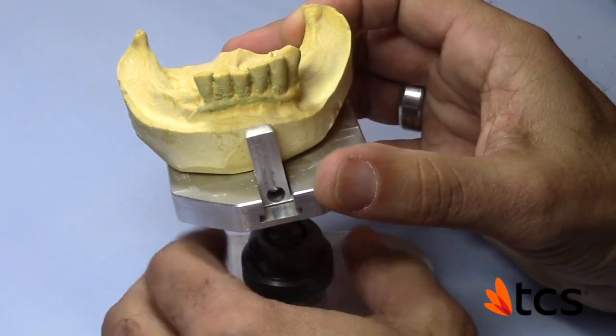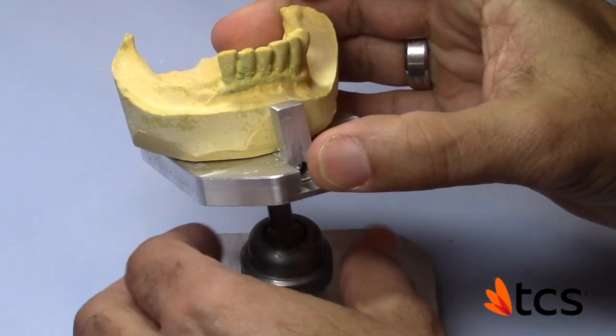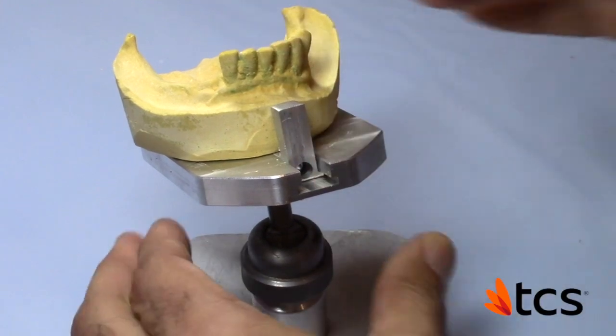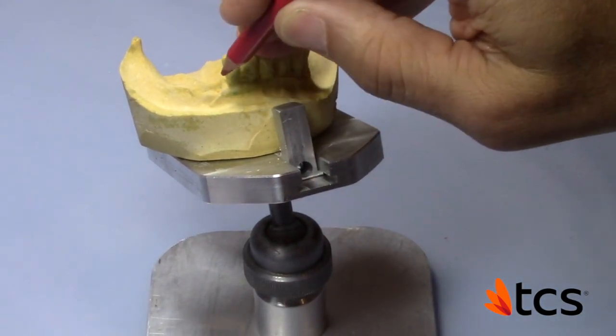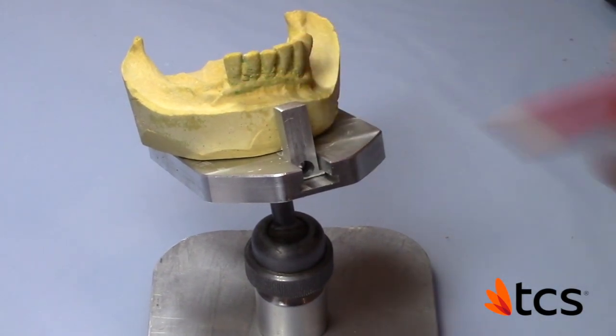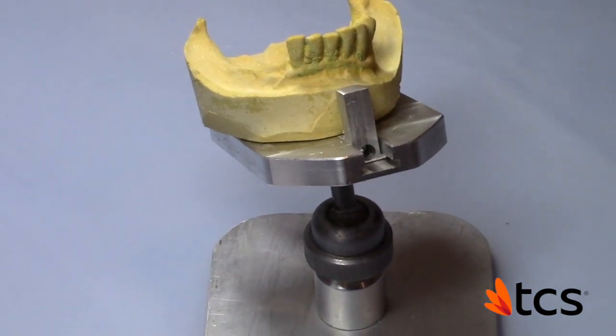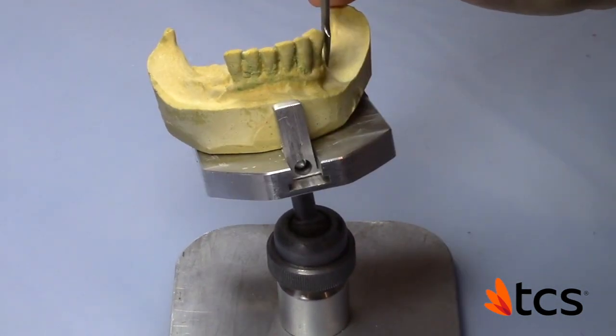It's very important to see this angle. The design here is going to be a little different because typically when we do a design on a clasp, we want to be about one to two millimeters away from the margin. But because of the angulation of the teeth here, we have these issues.